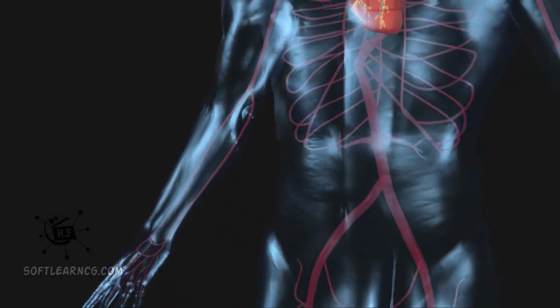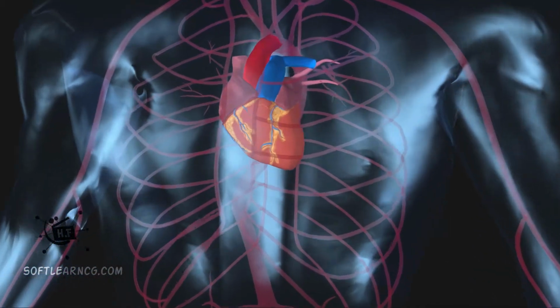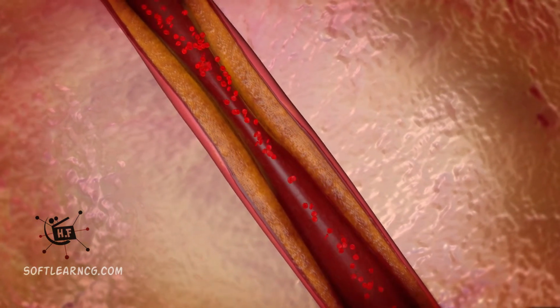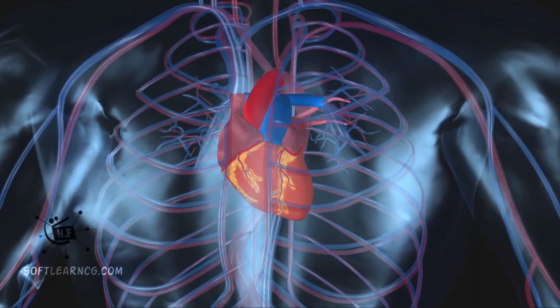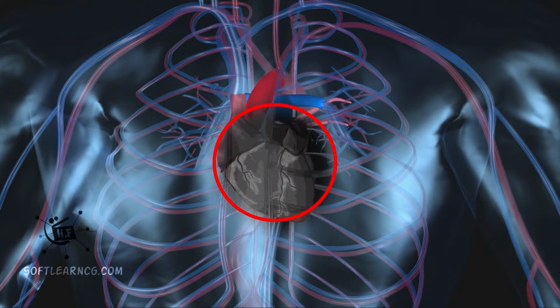The coronary arteries are important blood vessels that supply oxygenated blood to your heart. Sometimes cholesterol plaque buildup can cause a narrowing of the arteries and a dangerous reduction in blood flow. A coronary angioplasty with a stent placement is a procedure which doctors use to open up narrowed coronary arteries.